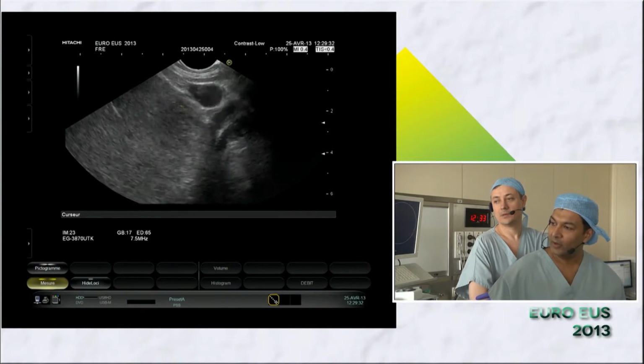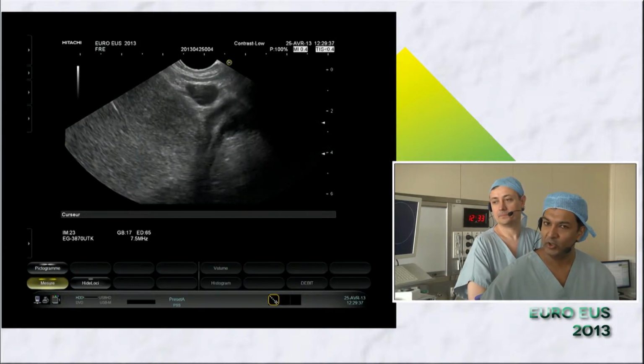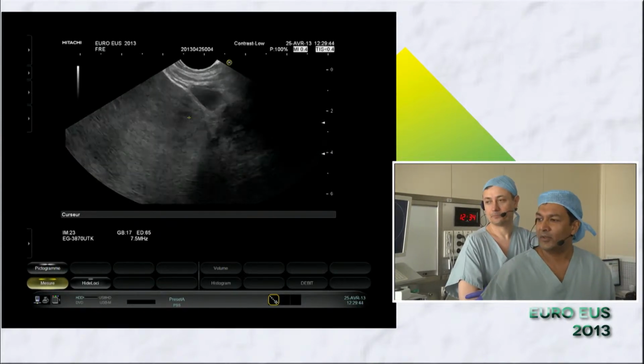I can tell you right now, you can see the liver lesion here. Okay, so here's the liver lesion, which is huge, and definitely looks solid. And it doesn't look calcified to me. I see no calcifications. So anyway, there's the liver lesion.